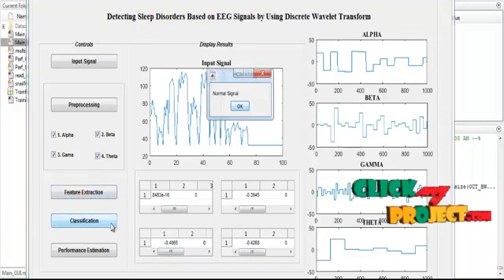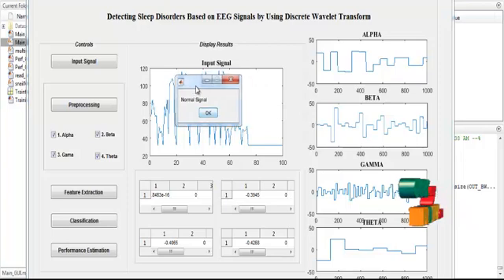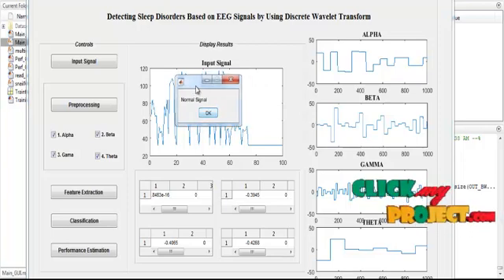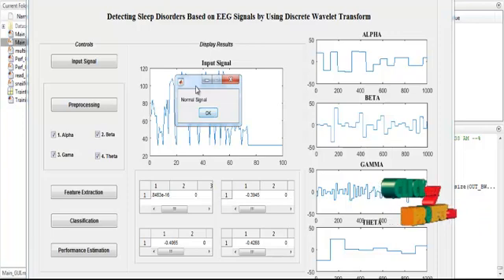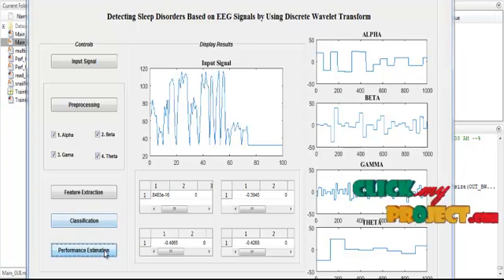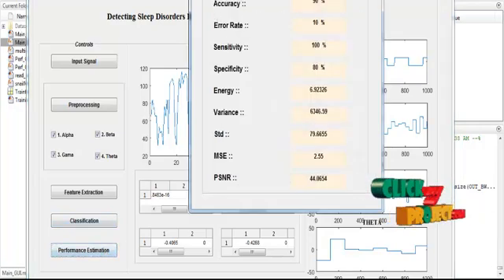After that, finally the classification will be done. In this classification process, it will be shown in the results as a normal signal. The input is the normal signal. After that, click the button performance estimation.